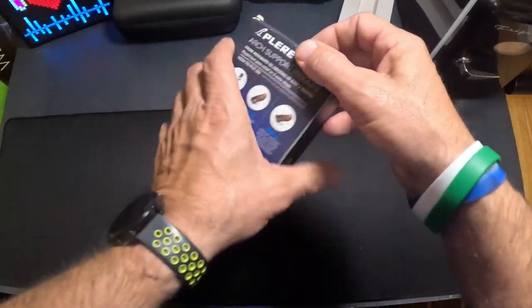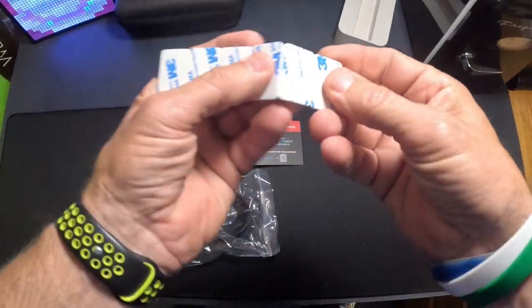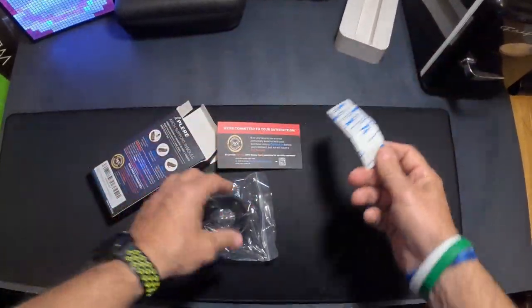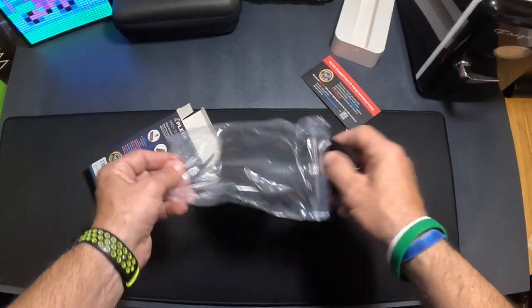I've got a pair of hiking shoes I'm going to use them in. Opening them up, you get a little 3M double-sided tape to put them in, and this is kind of like a little thank you card. Then they come in this little bag here.